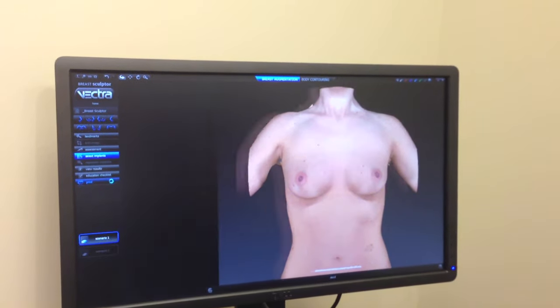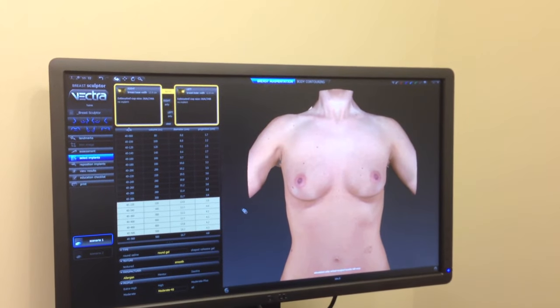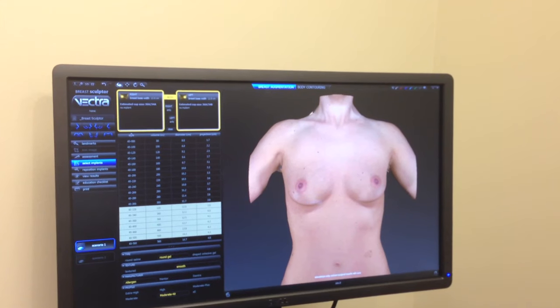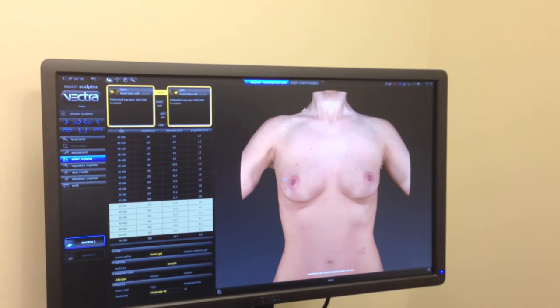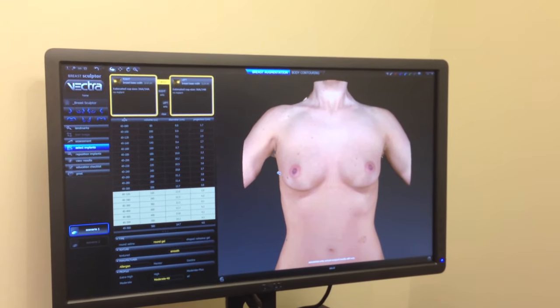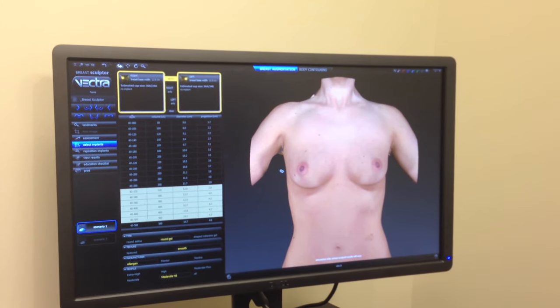So, we're going to go to the select breast implant module and with this module you can see over here on the right and the left we can actually put in different breast implants on either side. For simplicity, we're just going to do one size implant today and so this is a patient that wants to be relatively modest.